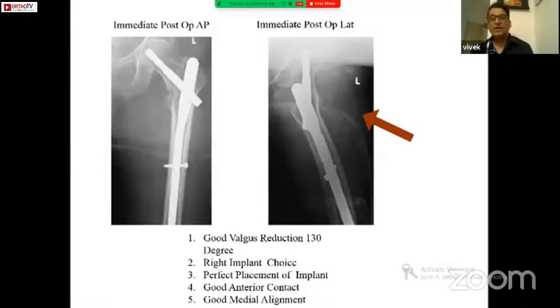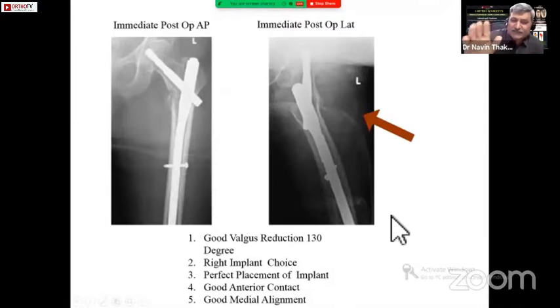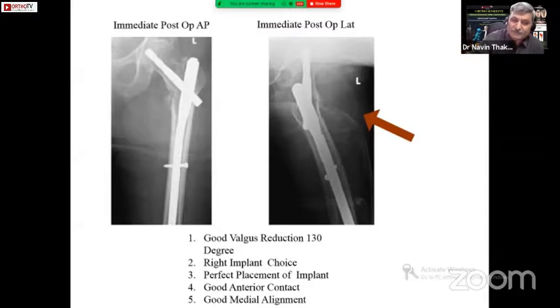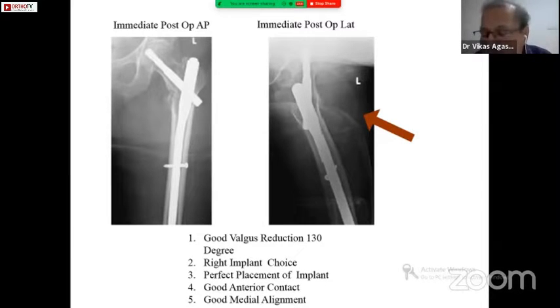That is a problem. Dhaval, if I may, can you see the lateral view without the arrow? Yes, my observations are two. See this, there is a distinct defect medially. As Shiva had said, in AP, yes, it is a comminuted fracture. Correct. So here, one could have a positive reduction with a little more valgus. Then you will have a good medial support also.